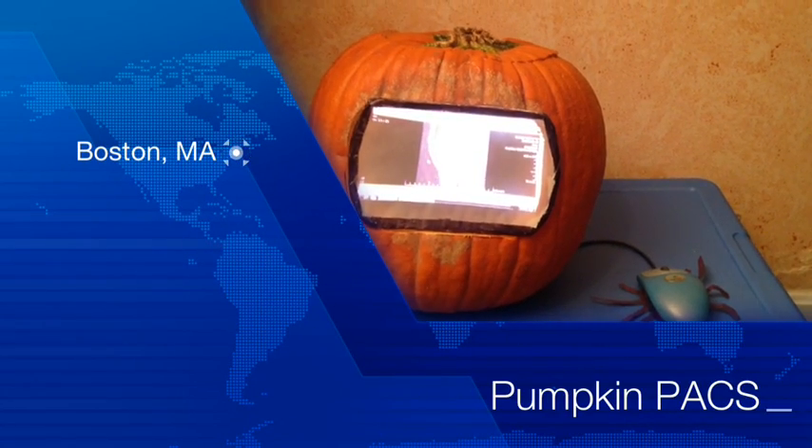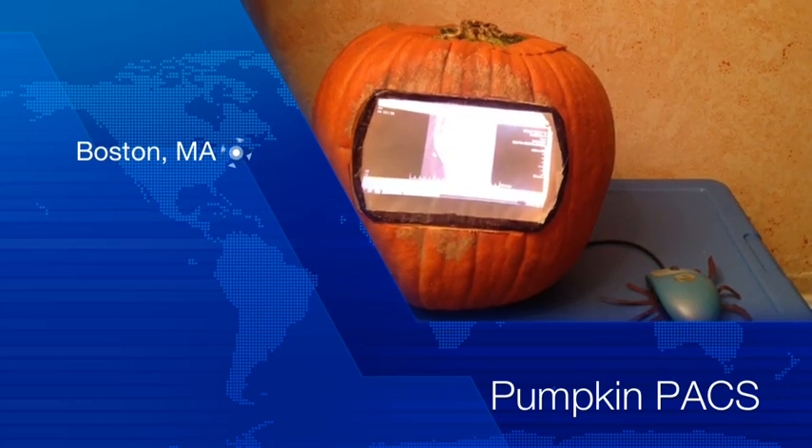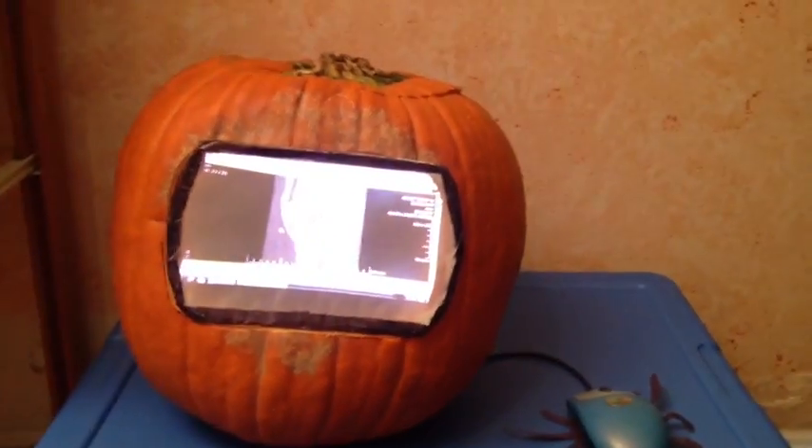This is a Pumpkin PACS — a pumpkin with a Raspberry Pi inside that can display radiology images.